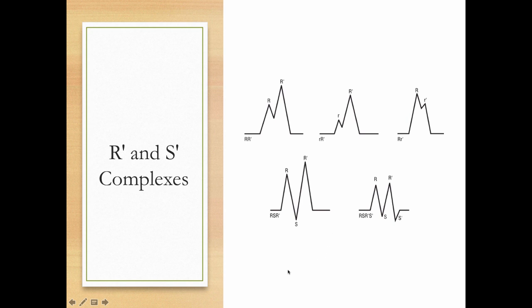But just to give you an idea of how we name our waves, the nomenclature of our waves. That gives you an idea of the bigs, the littles, the primes, and the not primes. Except for that guy.